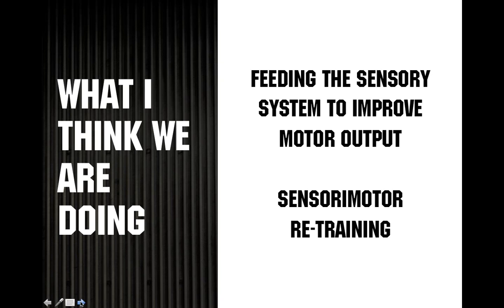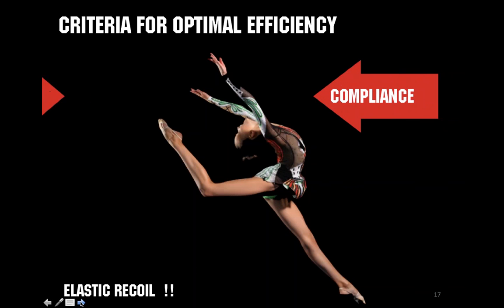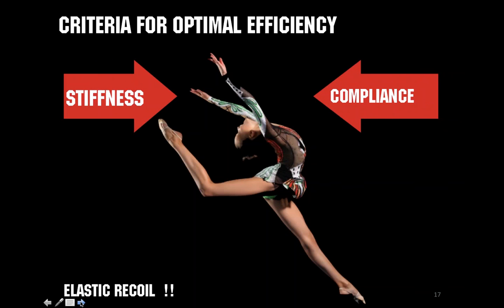We believe that inducing stimulus via a tool can help upregulate or downregulate the nervous system to get a better motor system response. When we think about tissue itself, we think about tissue being rather compliant or rather stiff. We know that in order to get through movement, you have to have stability within your system, but you also have to have the mobility within the skin and the fascia to move through that movement.